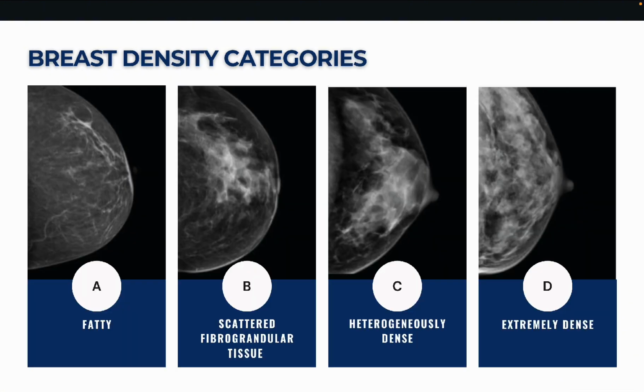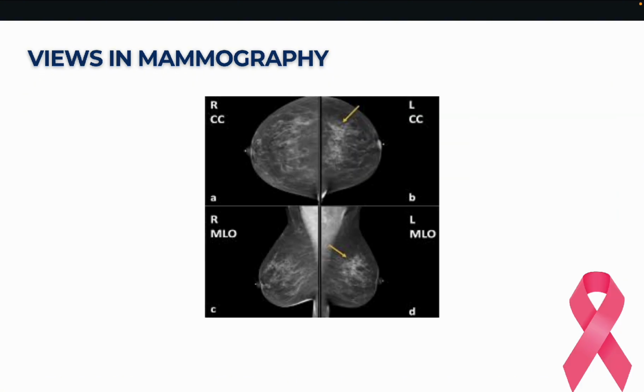So moving on to the breast densities. How do radiologists identify if a person's breasts are dense and on what scale? This is done by using the BIRADS system, which provides us with 4 different categories. When the patient is presented to them, radiologists take a mammogram and then they have these 4 views. The next step is to use the BIRADS system to classify each view image based on the density that it has.